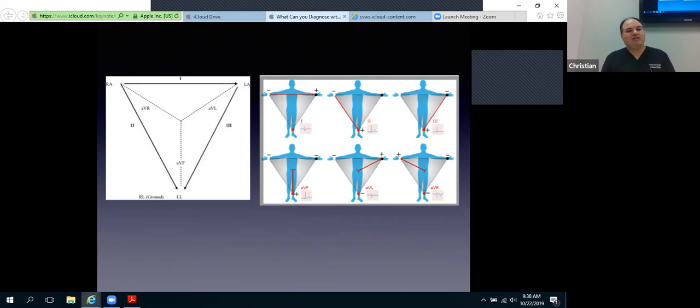Most of the devices come with extra wires to actually do 15 leads and 18 leads, but we don't apply them for many practical reasons, mostly that it takes much longer to do that. So again, that's kind of what the forces are.